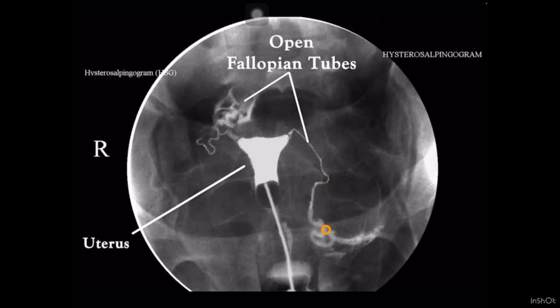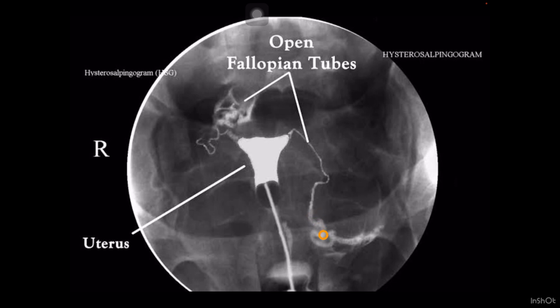The next part is the ampullary part. You can appreciate this is the ampullary part. How do we differentiate between the isthmus and the ampulla? The ampulla is the dilated part — it is dilated along with being serpigenous, meaning it has a tortuous serpentine-like structure. You can appreciate this is the serpigenous structure, and it is more dilated than the isthmus. Whenever we see the dilated serpigenous part, we call it the ampullary part of the fallopian tube.